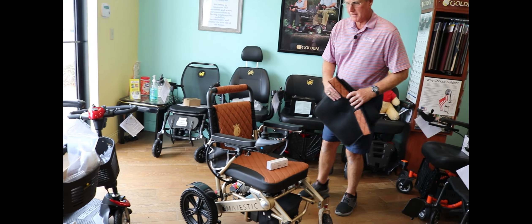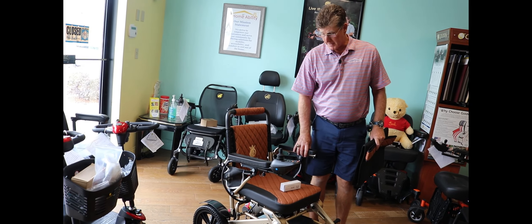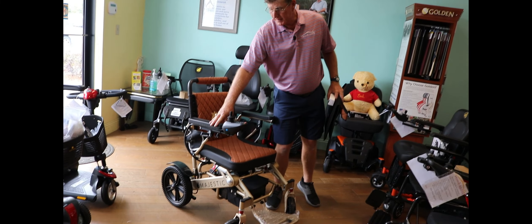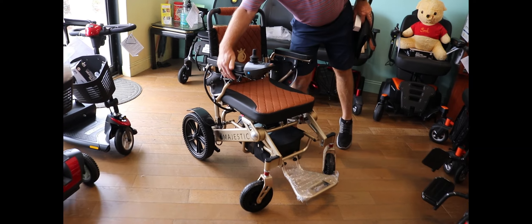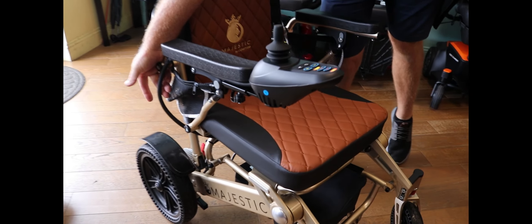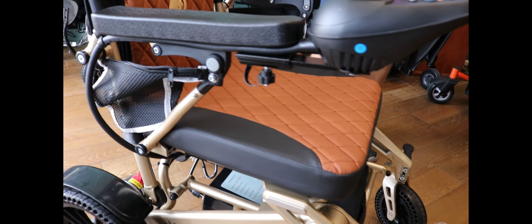Here are a couple of the big benefits: 330-pound weight capacity, very durable. It has a very solid joystick controller — look at the cabling that connects it. Very substantial and very durable.